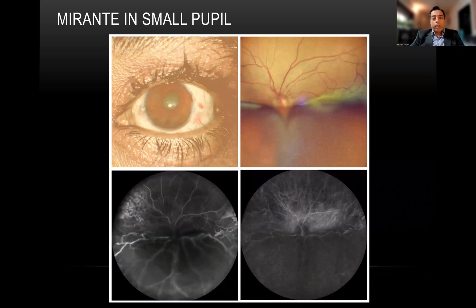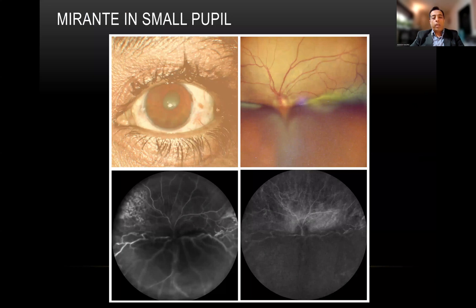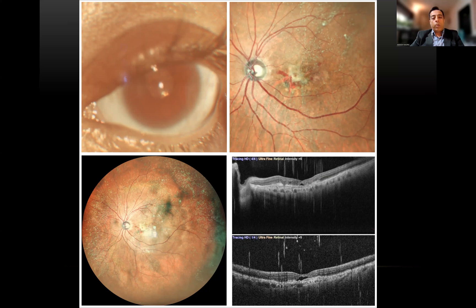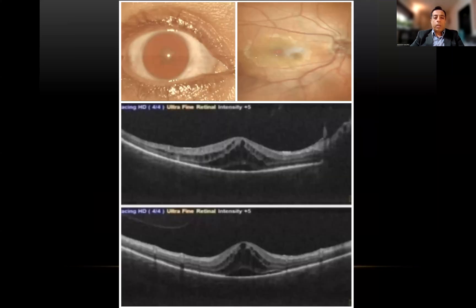Another impressive feature of Mirante is that it can go through very small pupils. You can see here the size of the pupil — this patient has exudative RDs which we can see very easily through Mirante's imaging, and we can also do an angiography to confirm the same. A patient with small pupils difficult to see clinically — we can now see a subretinal blood due to a subretinal membrane, and we could diagnose and treat the patient with anti-VEGFs. A patient with small pupils and uveitis — we can confirm a cystoid macular edema using the Mirante color photo as well as the OCT.